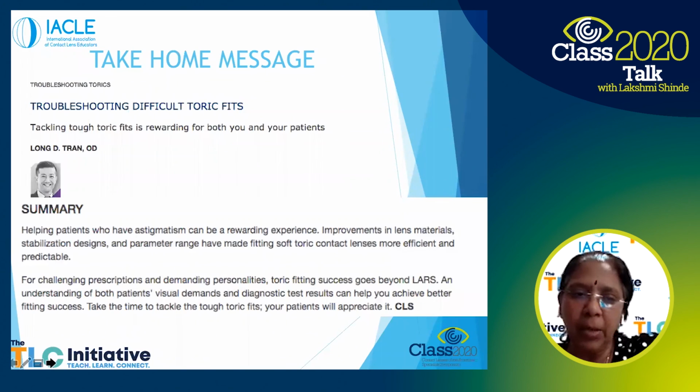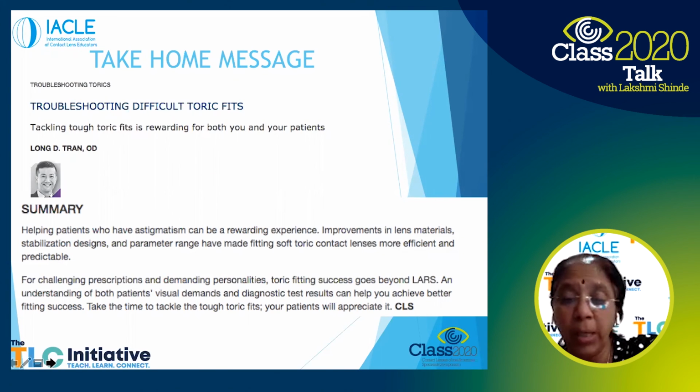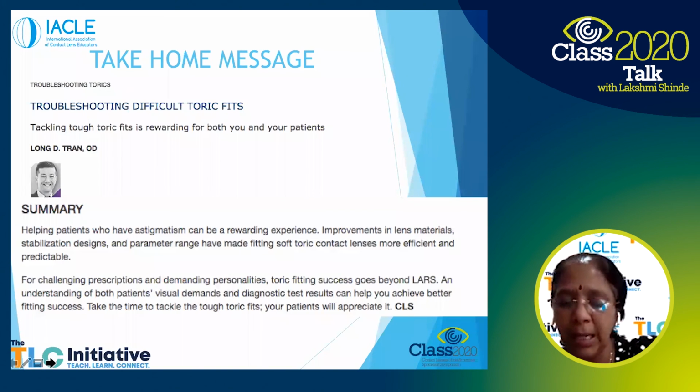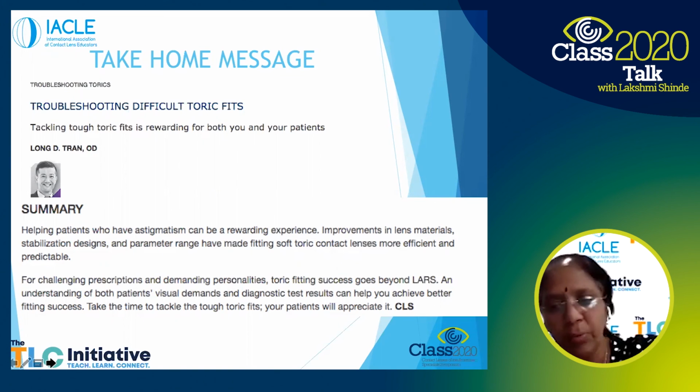Just to summarize, I thought this was a very, very good quote by Dr. Long Tran, where he says, helping patients who have astigmatism can be a rewarding experience. Improvements in lens material, stabilizations and designs and parameters have made soft contact lens toric fitting more efficient and very, very predictable, which is very true. And that is why industry always tends to give you a first fit guarantee in terms of soft toric lenses.